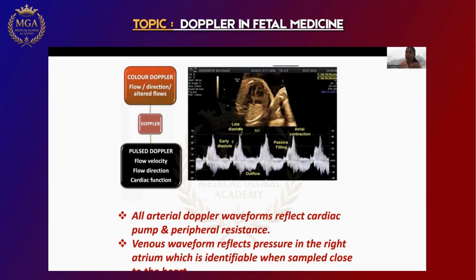To quantify what is the systolic flow, what is the diastolic flow, how the heart is functioning, we need to calculate the rate, the flow, the volume, the speed, everything. That we do by something which is known as the pulse wave Doppler. This is how a pulse wave Doppler gate looks like. Do you see these two lines over here? This is the gate of the pulse wave Doppler. When you put it, you will get something like pulsatile flow, and it will show you which direction, what is the velocity, everything you can calculate using this technique of pulse wave Doppler.